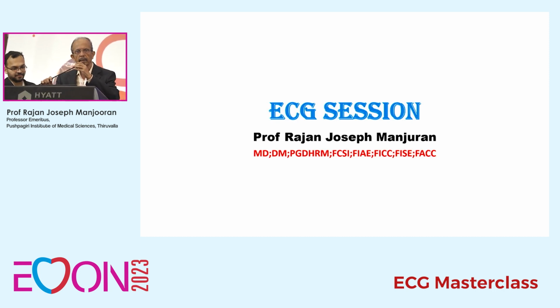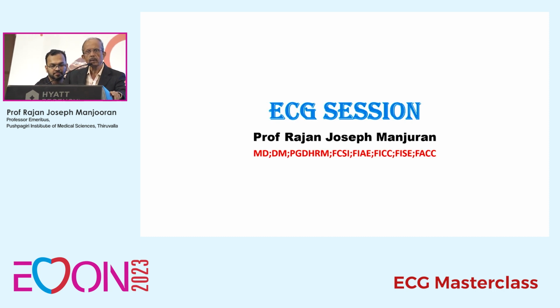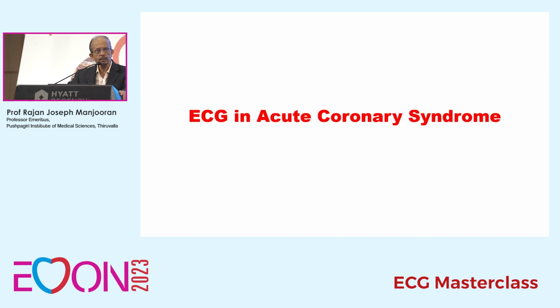The ECG talk is divided into two sessions. First, I will tell something about the role of ECG in acute coronary syndrome, and then there will be something like a quiz program, which is meant for the postgraduate students. Can the postgraduate students raise their hands?